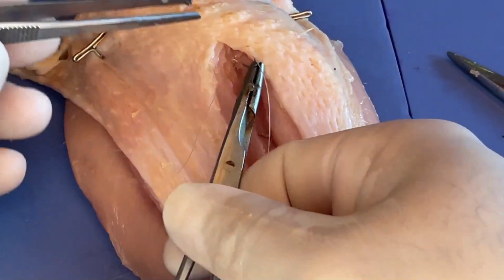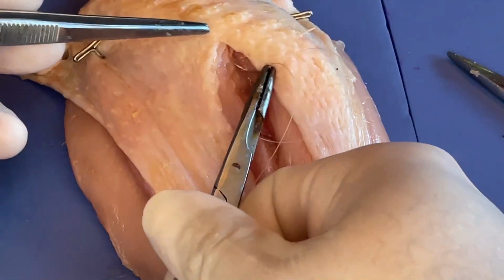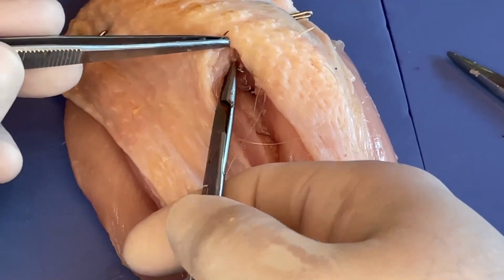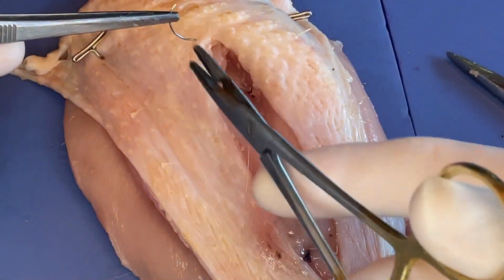So what we're going to do is we're going to come through the deeper tissue to pop out right at the apex, right there. And this is where we're really going to start the closure of the skin itself.